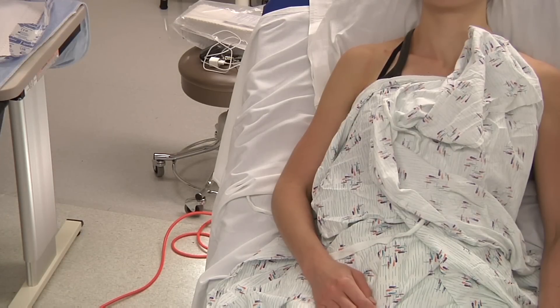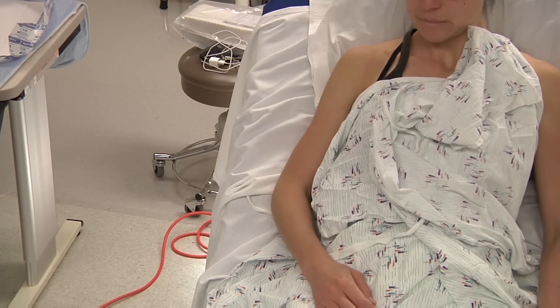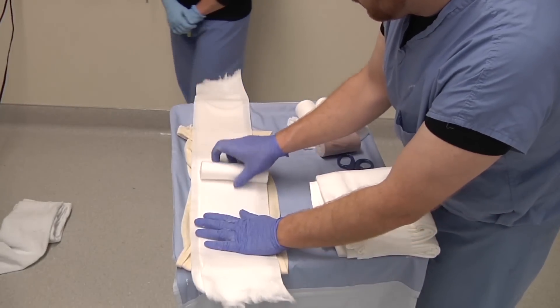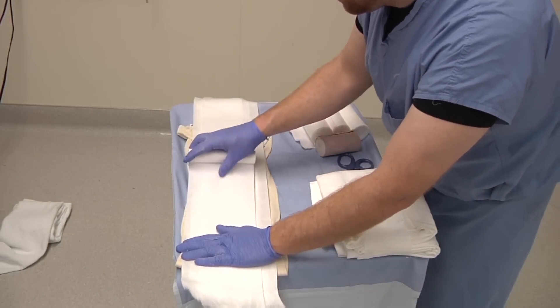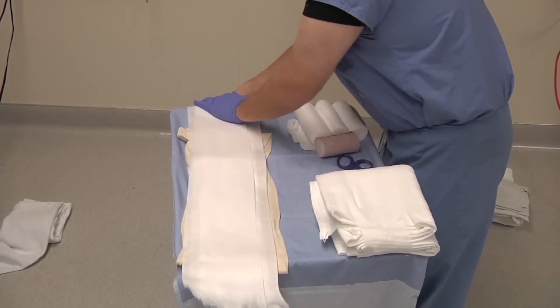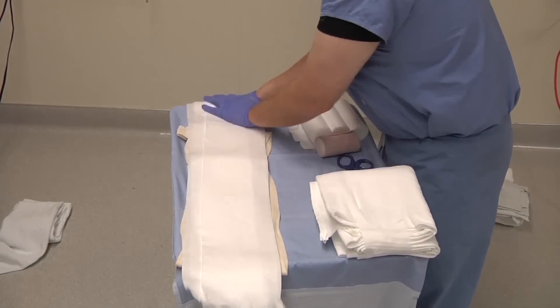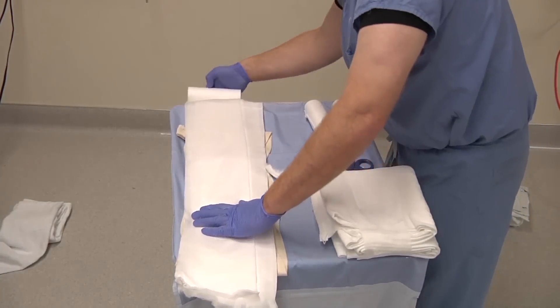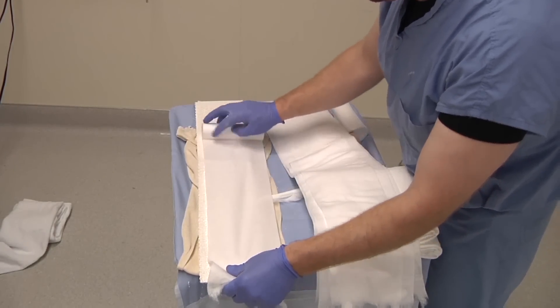The next step is to make your padding. We do this by using our measured plaster as a guide, and about two inches on either end, we start layering about five or six layers of our cotton web roll, offsetting it a little to adequately cover our plaster. We use 5-inch plaster and 6-inch web roll, so it does have some natural cover. We are going to need two of these, one for each side, so repeat the process.